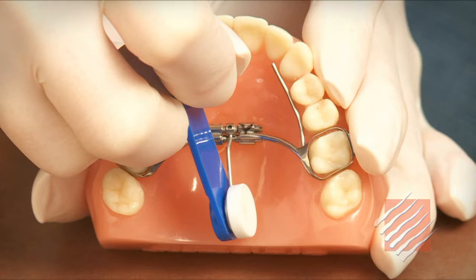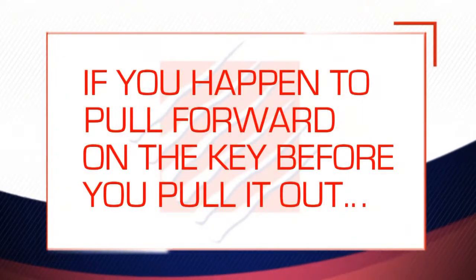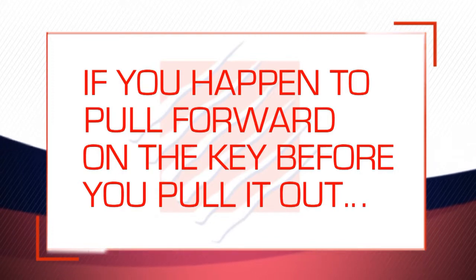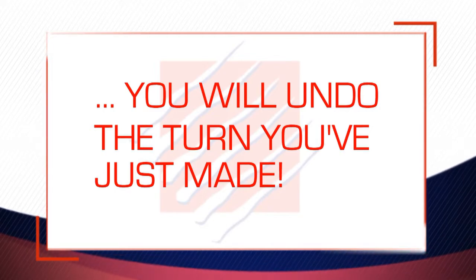Once you make the turn, be careful taking the key out of the hole, because you need to make sure that the key remains in its current position. If you accidentally pull forward on the key before you take it out of the hole, you'll essentially undo the turn you just made, so watch out for that.